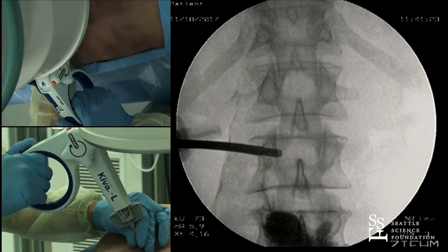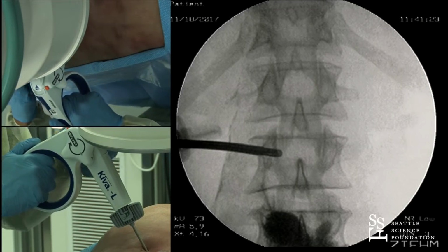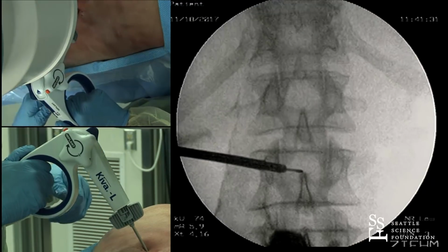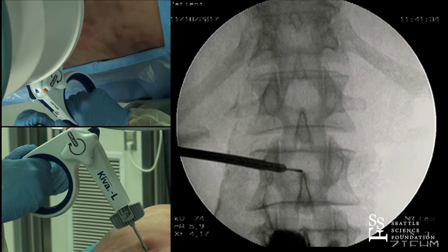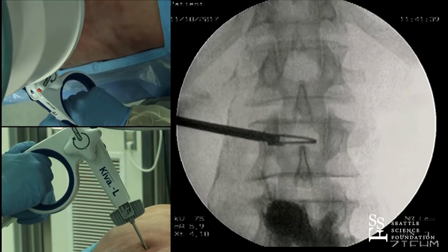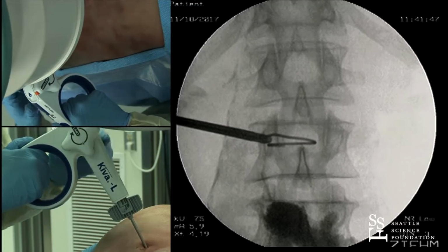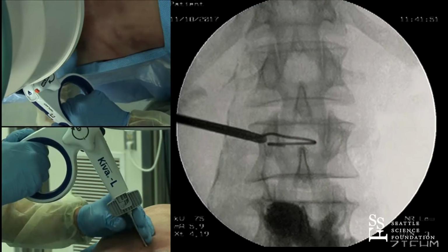Okay, so we're going to deploy this. Spine surgeons use this criteria, starting off with the coil. Expand between the pedicles. So, a little bit more toward the center of the vertebral body, kind of like this. Yeah, we're a little bit toward one side, but that's just how it's going to be. A little bit of wire buckling in this frozen cadaver.